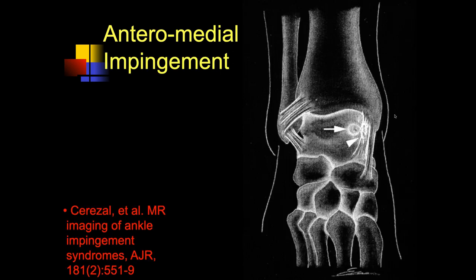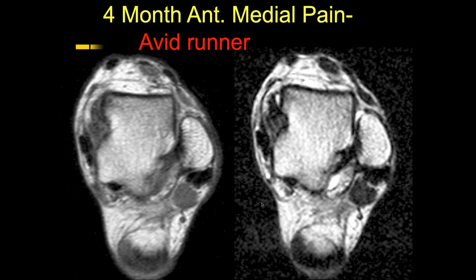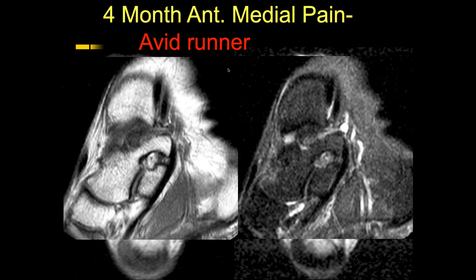Anteromedial impingement is typically soft tissue impingement. A patient with four months of anteromedial pain who is an avid runner. There is soft tissue thickening and prominence along the anterior medial ankle — anterior medial impingement. The adjacent flexor tendons are intact. We can see effacement of fat and soft tissue thickening. This was anteromedial impingement due to repetitive trauma from running.